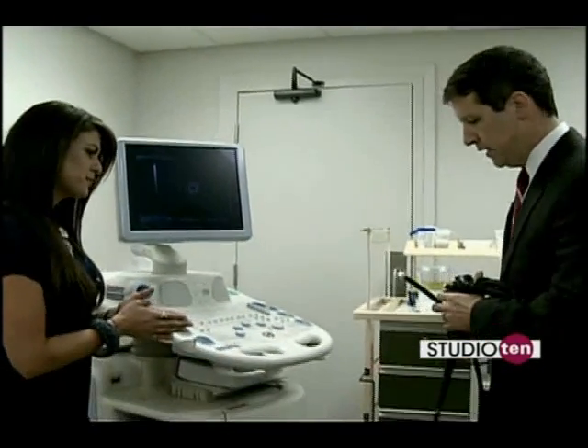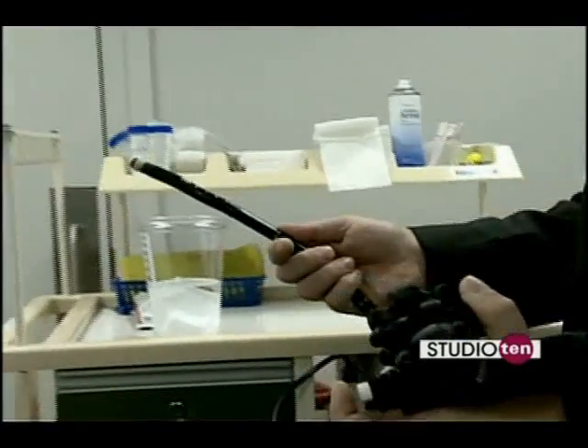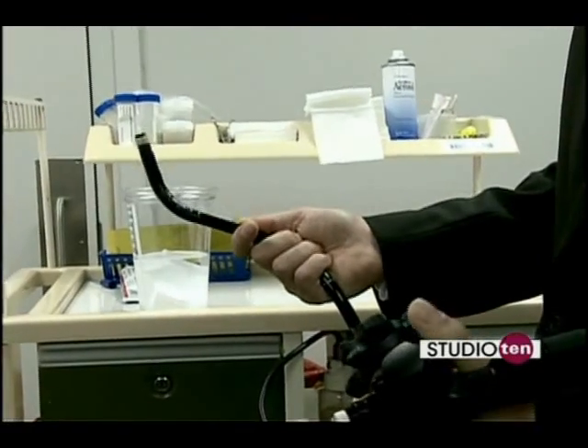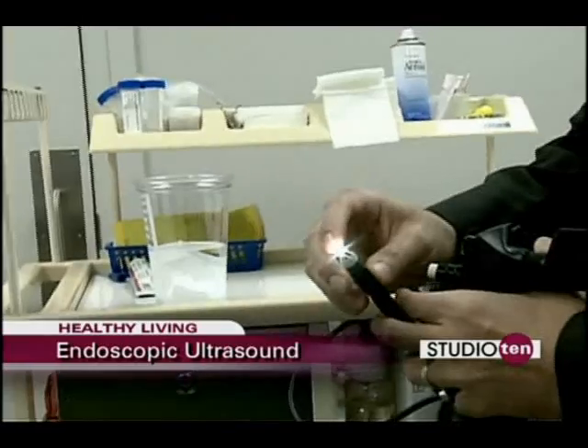Can we see how it works? This is actually the scope here. We can actually drive the scope by using these dials here, very similar to a regular endoscope. And we have the light source here.